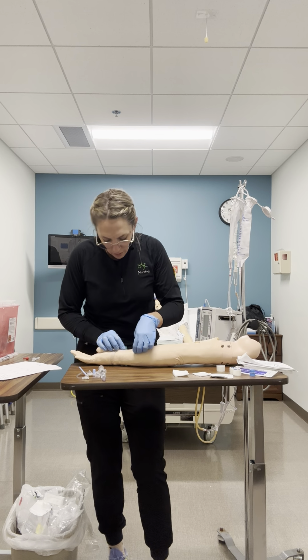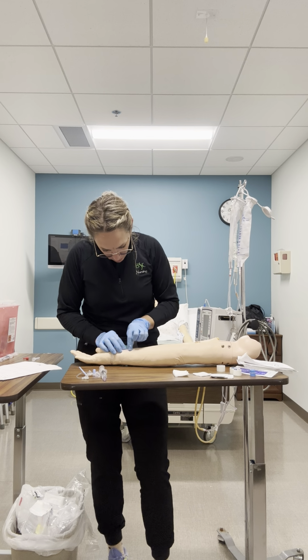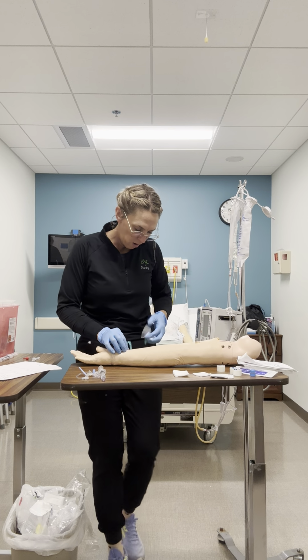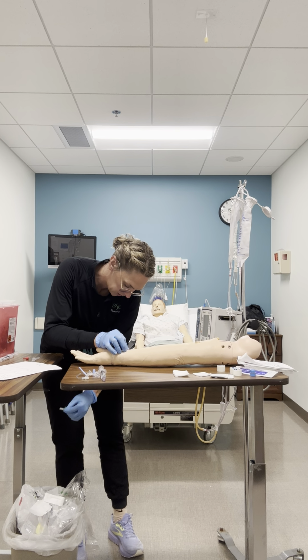And then I would take my, holding my catheter, taking all of my plastic off while still holding the catheter. All of the Tegaderm that's sticking to me.